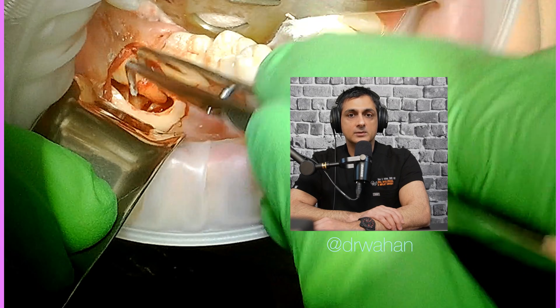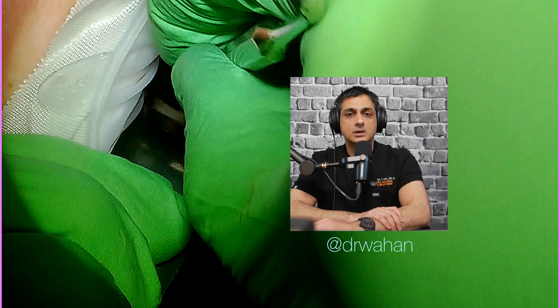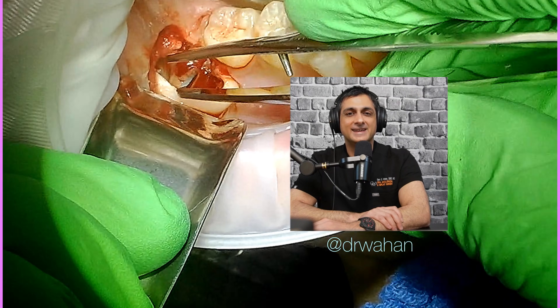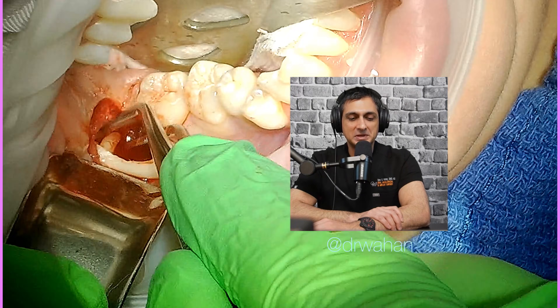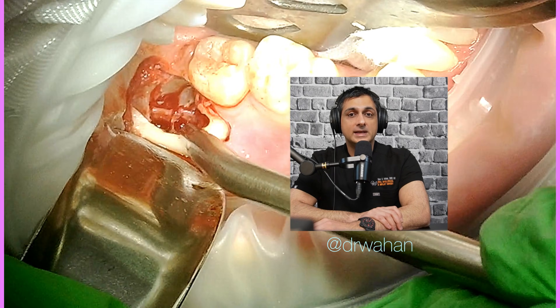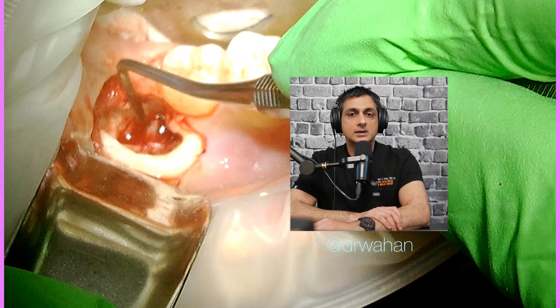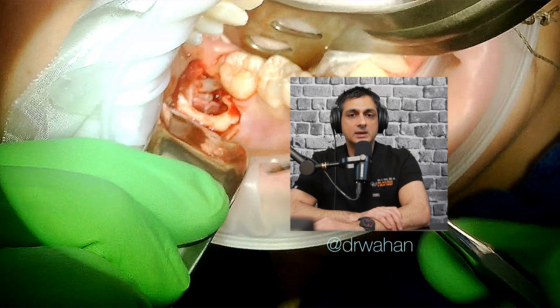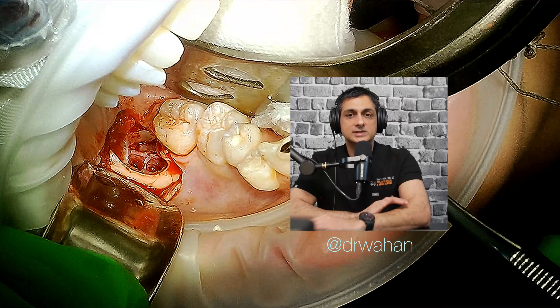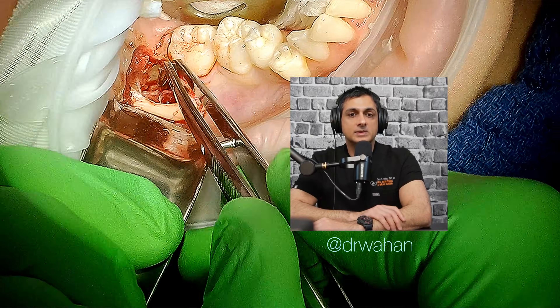Got that root out using a pickup. There are still more roots — these wisdom teeth normally have two, but this one had four. I can actually see the nerve now. Normally when taking wisdom teeth out you don't see the nerve, but here I can. There's another root tip just behind the nerve on the lingual side — that's the fourth root. It moves, but every time I push it I feel it displacing inferiorly and I don't want to lose it in the canal.